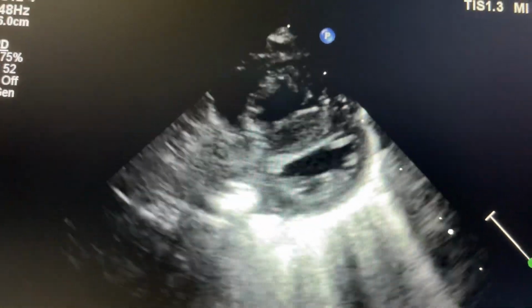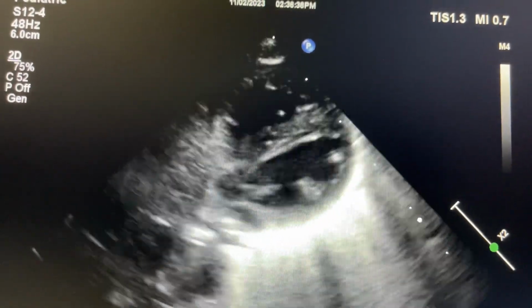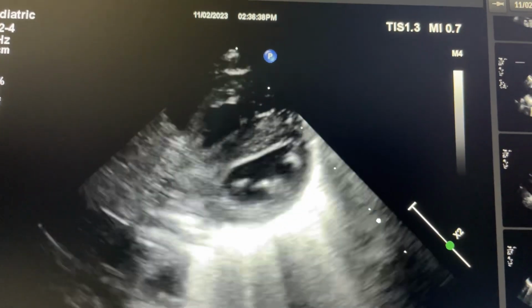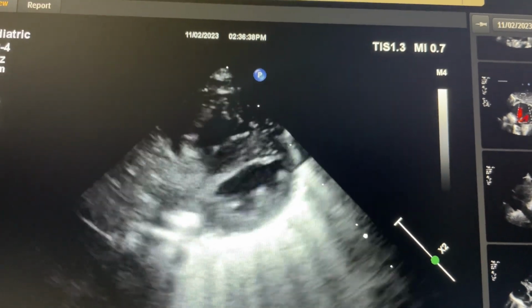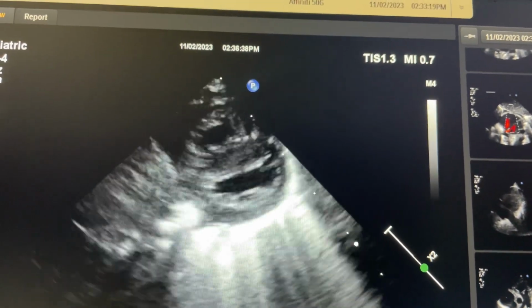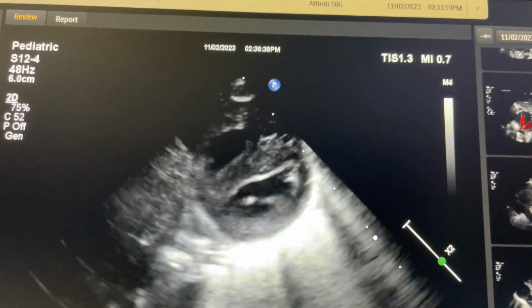Left ventricle chamber is D-shaped, suggestive of raised right ventricular systolic pressure. Due to raised right ventricular systolic pressure, IV septum is behaving like part of right ventricle. So whenever there is contraction, the interventricular septum remains as such, so LV appears like letter D. So D-shaped left ventricle always indicates increased right ventricular systolic pressure.